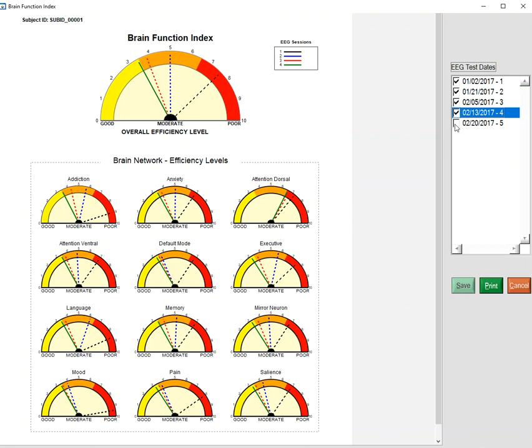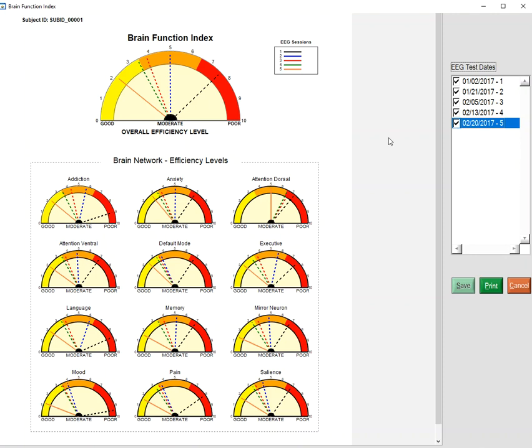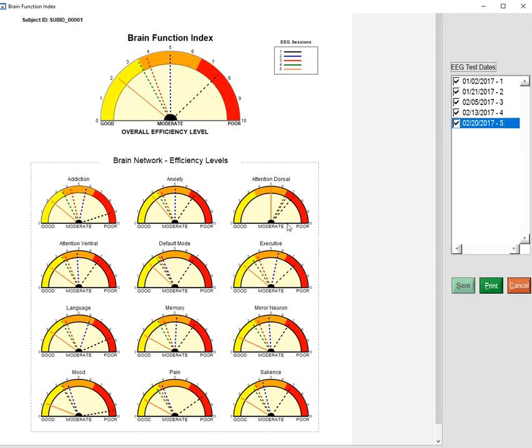And then after the fifth biofeedback session, this individual is doing quite well everywhere, except now the attention dorsal attention network still could use some work. And this is an example where you can continue to improve functioning in your patient or your client by identifying those networks that are least close to the peak performing networks. So this is the brain function index.